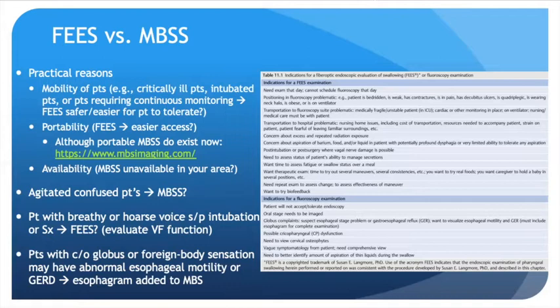Availability might also differ of FEES versus modified barium swallow studies. So availability is always going to be a factor. If the patient is agitated or confused, perhaps a modified barium swallow study might be a better choice given the patient's difficulty in cooperating for the transnasal endoscope placement. Patients with breathy or hoarse voice after intubation or a surgical procedure might be better for them to have a FEES because you can also evaluate vocal fold function as well.